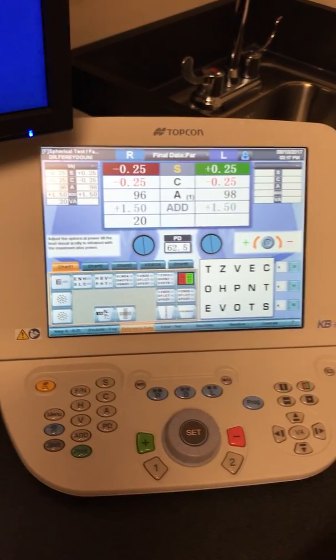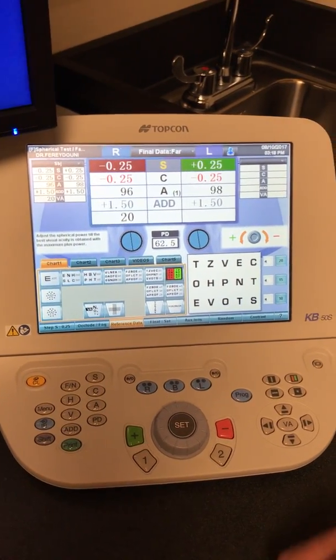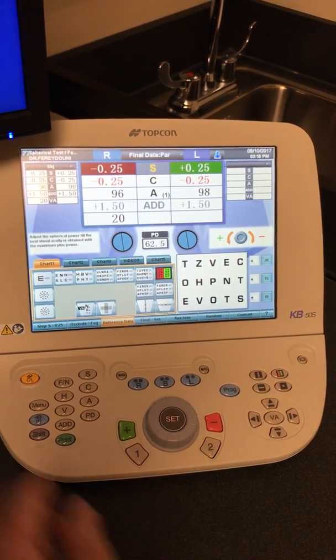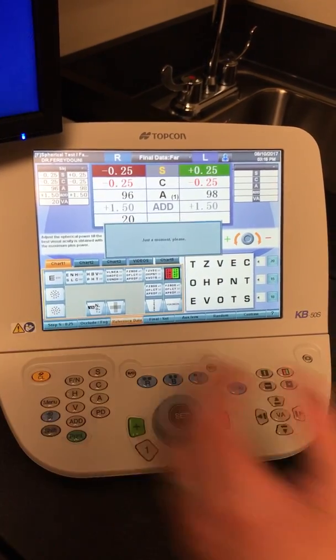At this point, until we're connected to the EMR, we'd have you write all this information down. And then when you're finished writing all that down, you can hit the clear button, and it'll clear everything up.